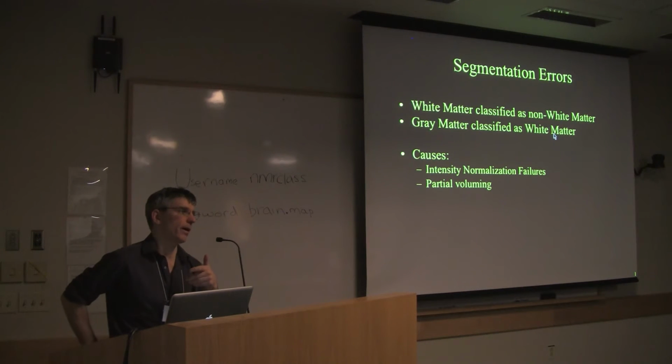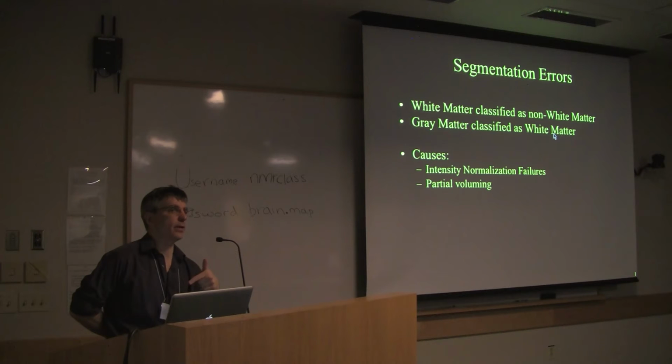So the threshold that he's talking about is an input to recon-all, that you can actually go in and say change the minimum threshold, change the maximum threshold. And in that way, you can also alter how much the skull stripping will remove. So if it's removing too much, you could go in and say lower a threshold or so. In that case, the rule of thumb is that if you're having to do the same thing over and over again, then it's probably some quirk of your acquisition that is causing too much to be removed or not enough to be removed. And in that case, you would probably want to make a global change and just change it for everybody.